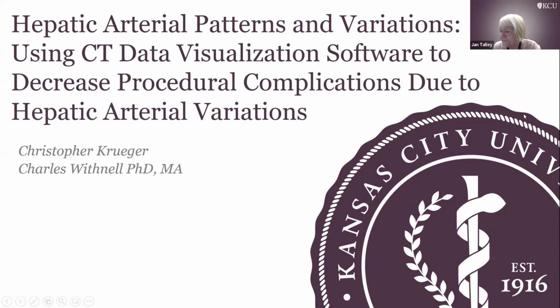Go ahead, Chris. Hi, everyone. Thank you guys for coming. My name is student Dr. Krueger, and today I'm going to show you guys how to use CT scans to make 3D models to map out arterial variations.